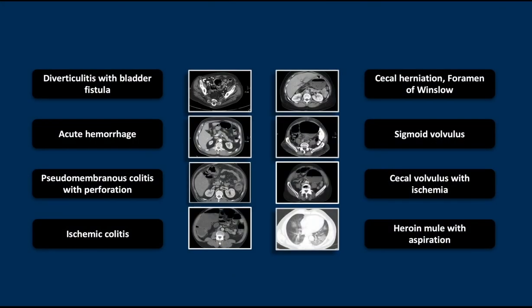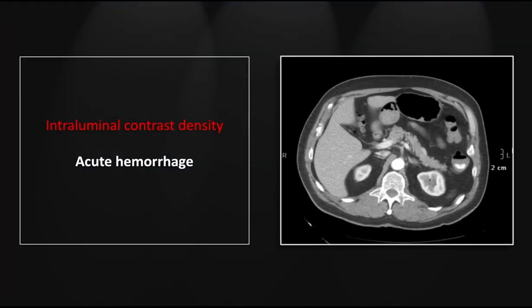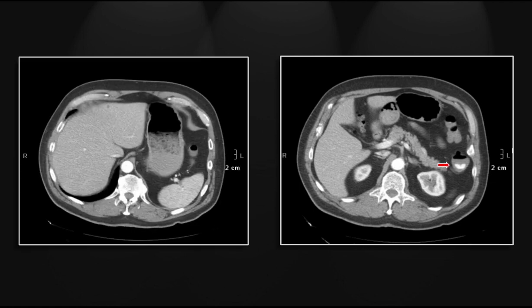Our next case is of acute colonic hemorrhage. This is not particularly challenging, but the CTA for acute colonic hemorrhage is becoming a very commonly performed examination. For the sake of everyone's edification, we'll look at one simple case of it. You can see the contrast density within the lumen there in the descending colon.